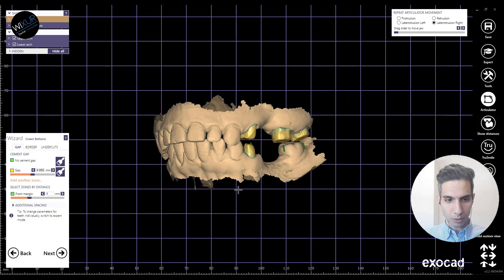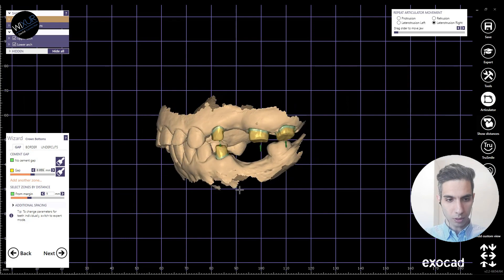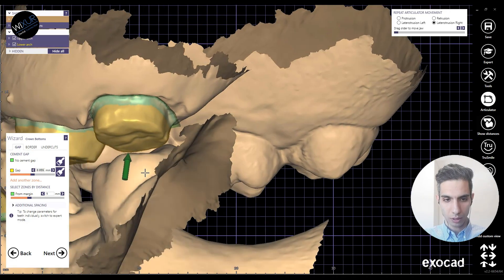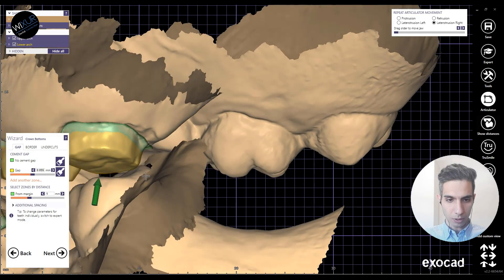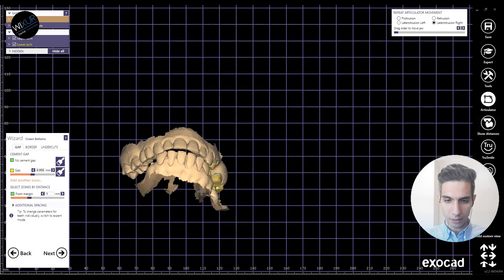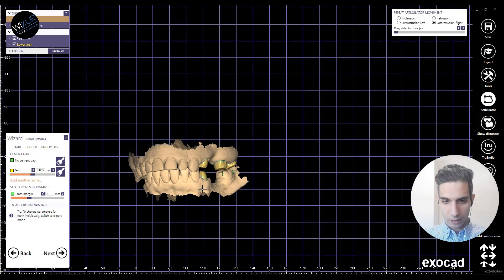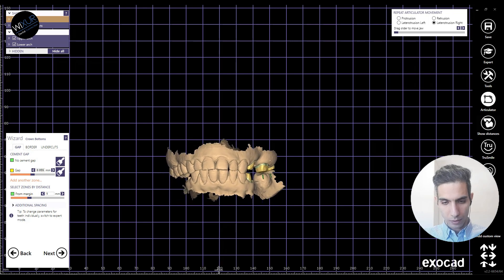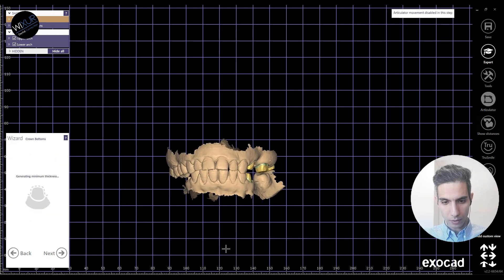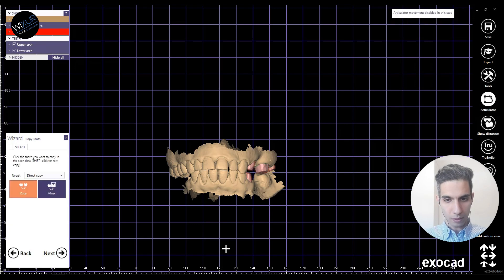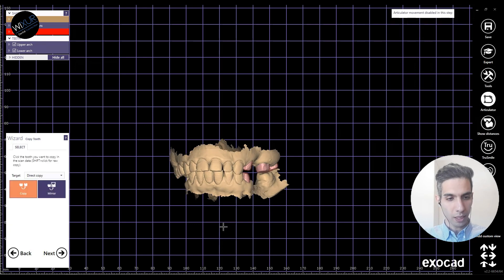Here are the crown bottoms — I'm not going to do anything here for this one. As you can see there is a little space for the last molar that I have.